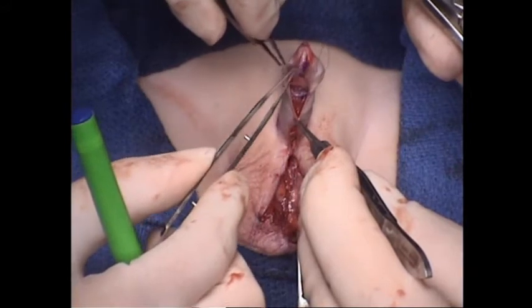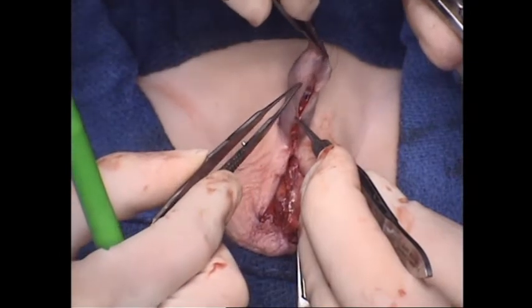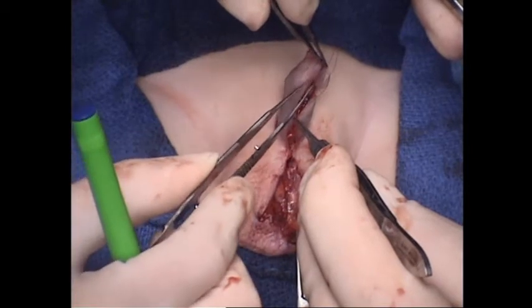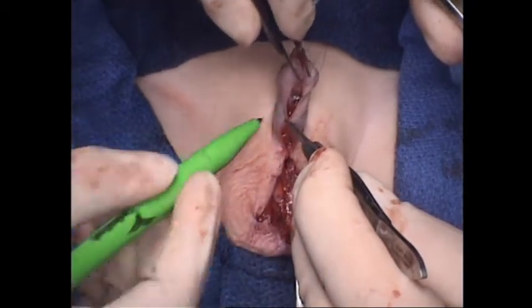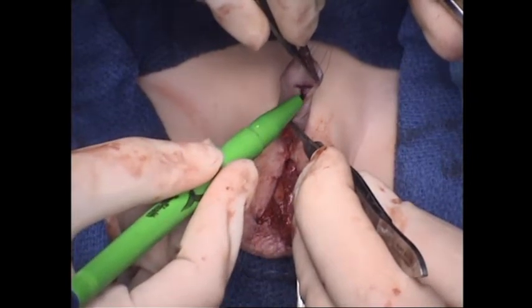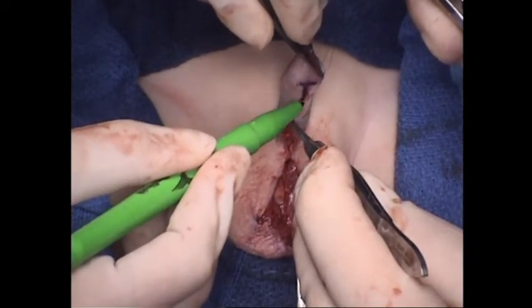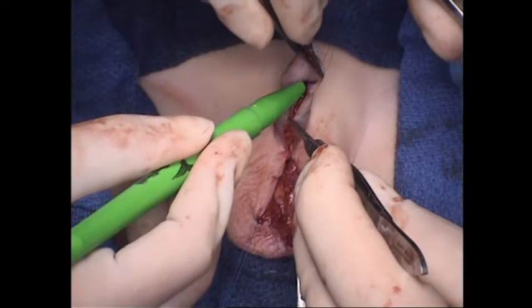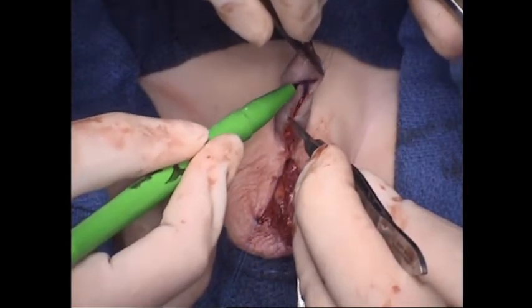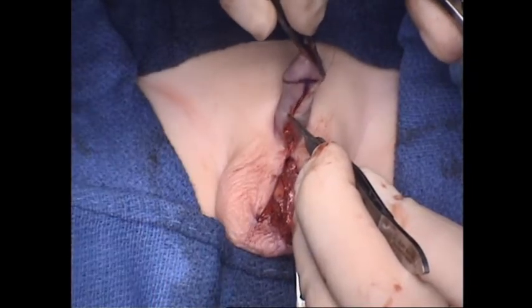And then that really allows you to see exactly where you need your skin. So I'm going to cut and mark right here along where the corona is of my penis, and everything that's distal to that. And in fact, a little bit of this corner right here, because you can see this is crossing the midline. So anything beyond midline we'll take with our graft. So our ventral penile skin is going to come to this corner right here to sew to the mucosal collar. And then I'm just marking right along where the glans is.